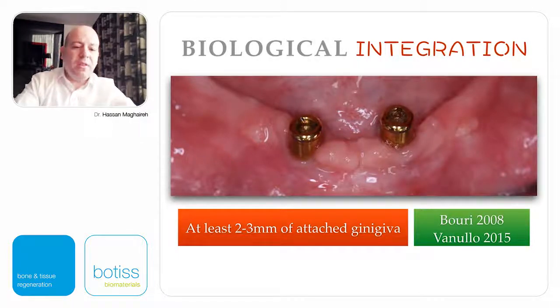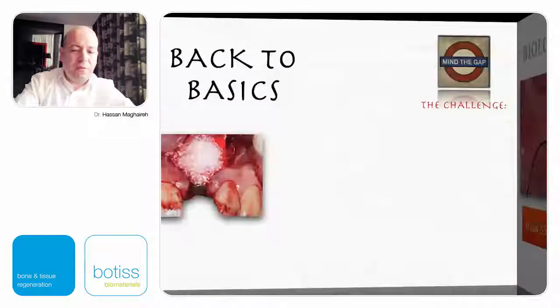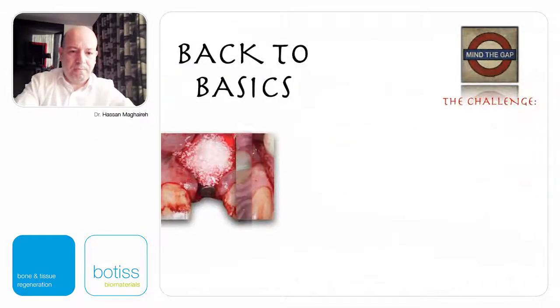So rather than brushing their implants for the good 2 minutes, they're going to do it for 10 seconds. It'll be very painful, they stop. And hence, you get plaque, and hence you get gingival inflammation, and you can get labial bone loss. You could tell the difference between the right and the left.